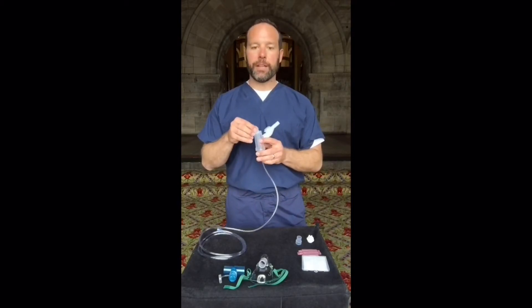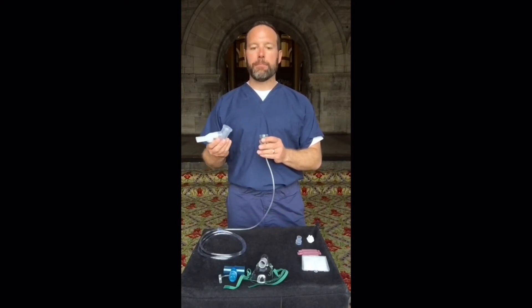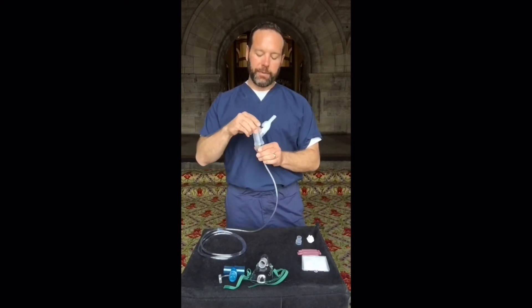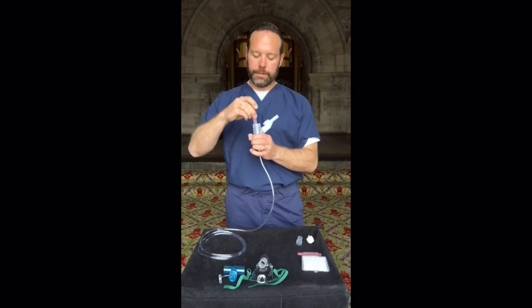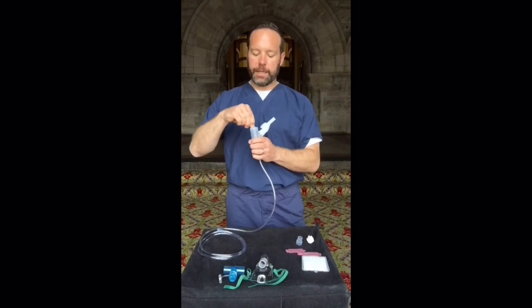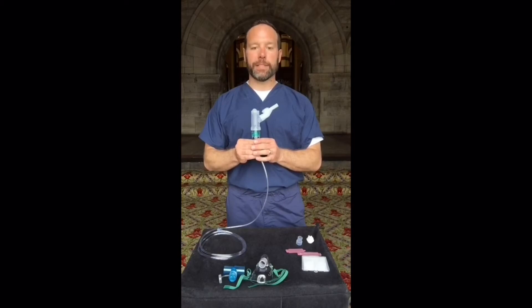To put medication in the Nebutek, do not remove the tower from the nebulizer because that makes it easier to contaminate the device. The easiest way to fill is to remove the inspiratory valve from the top of the tower, squeeze medication into the Nebutek, and replace the inspiratory valve. The Nebutek has a capacity of 6 milliliters — do not fill above 6 milliliters.